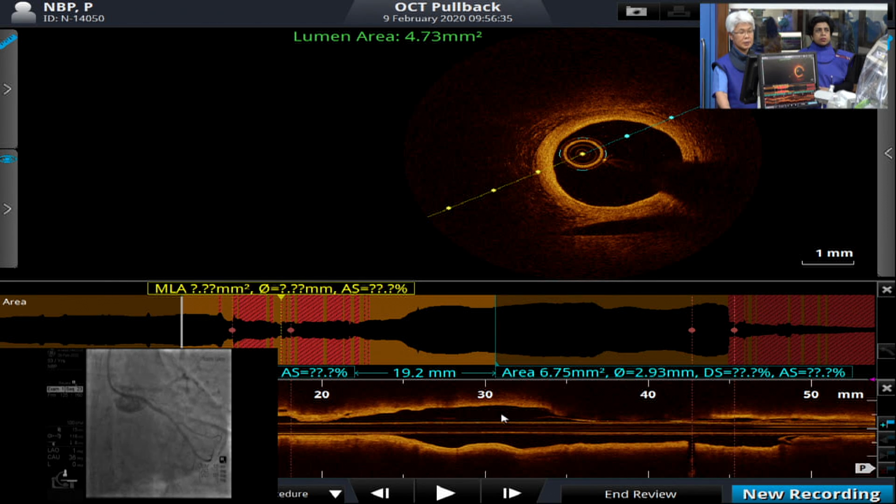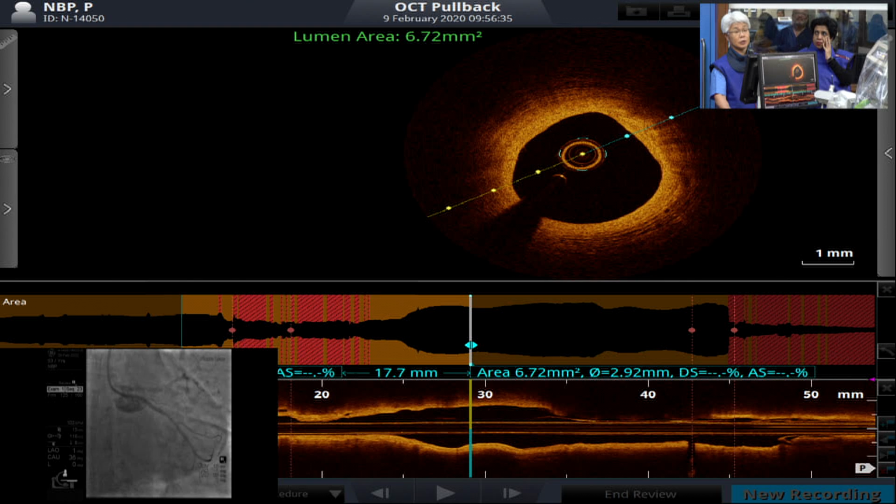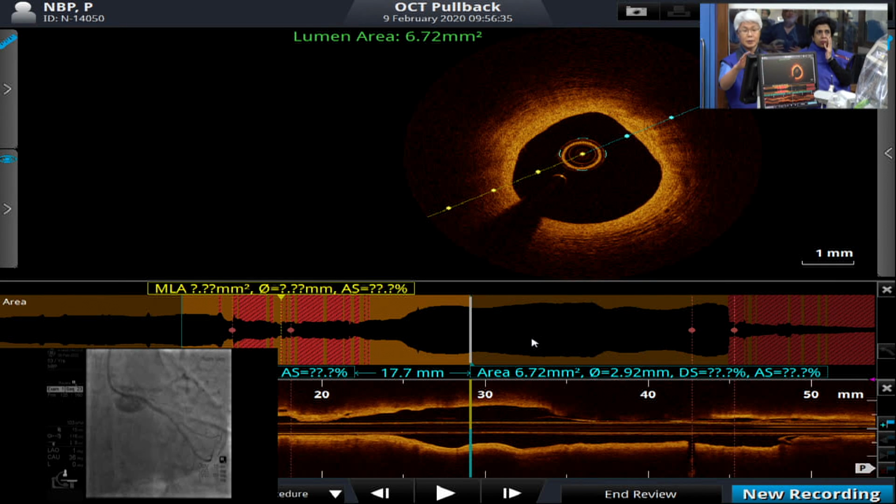So you can select the 3.0. If you select the 3.0, try to put it very gently. Okay, let's do that. And then we can retract, take out, and go back up. So 3.0 by 18? 3.0 by 18. The length is? 18, wait a moment. 18 should be good. Here is an 18, right? 18 is okay. Yeah, 18 is good. Yes, 3.0 by 18.